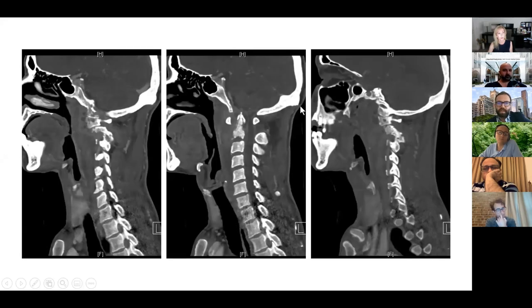Now, this is the CAT scan that was also obtained at the index presentation, the same day he presented. That's a CT of the neck, CTA of the neck, and we see similar findings, but it definitely gives us more details on what's happening to the bony structures. It includes the ADI here, involvement of C2 here, and definitely involvement of the condyle, C1, and also the C2 facet. We can see a little bit of subluxation here bilaterally.